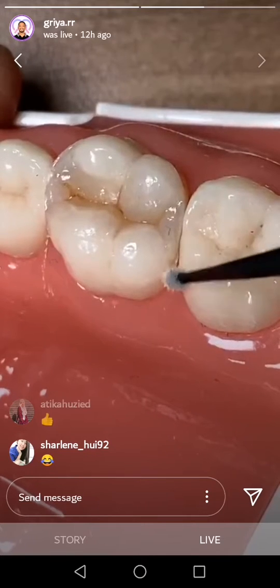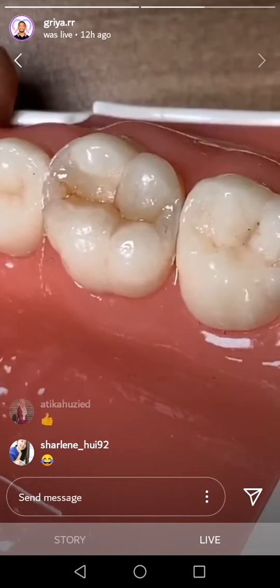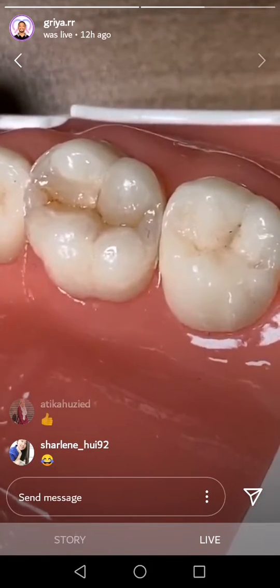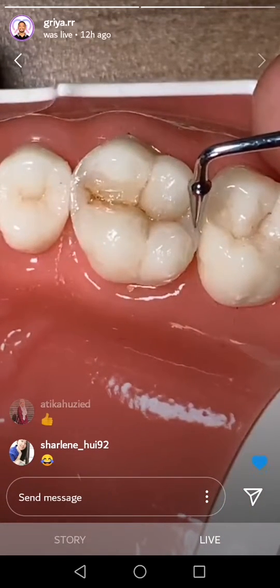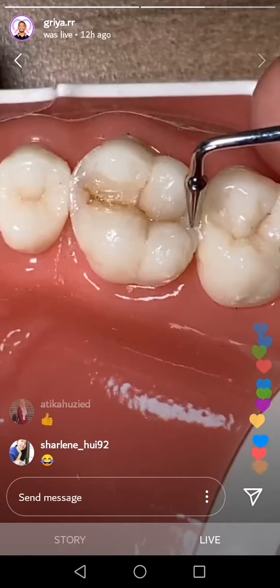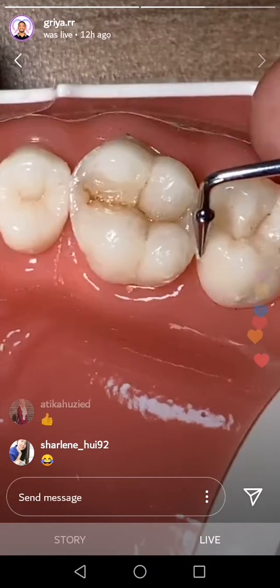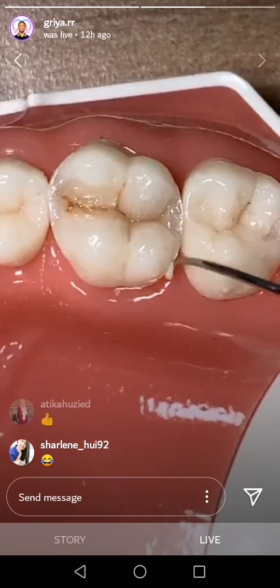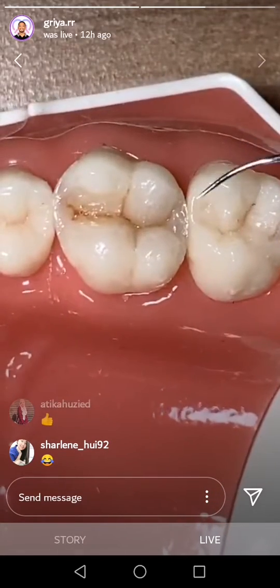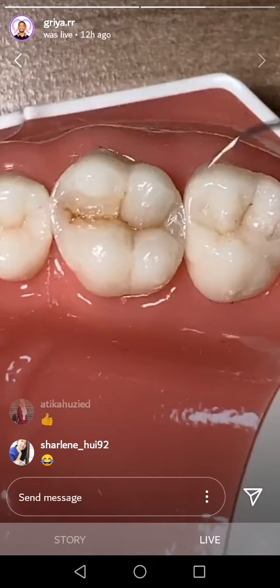Oh my god, I have a black hair. Oh my god, aku ada black hair. I don't know from where. From micro brush. But it's okay, this is only practice, yeah? No need to be so perfect. I just want to show you.